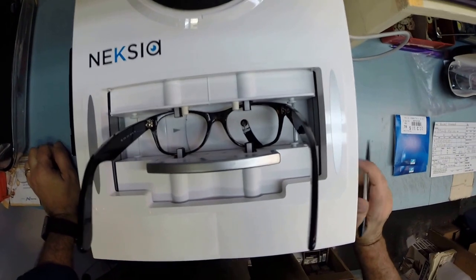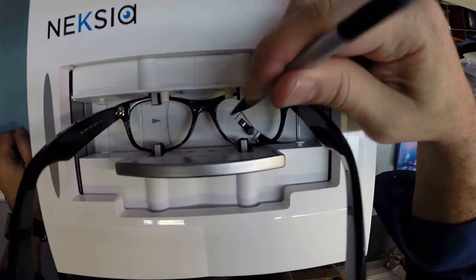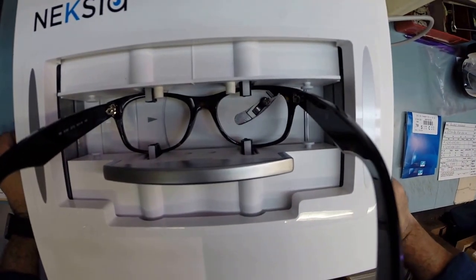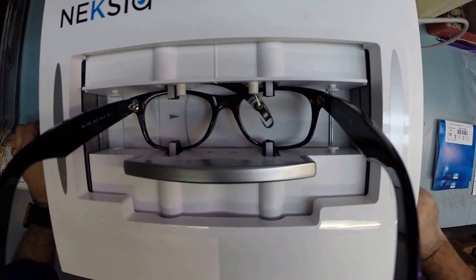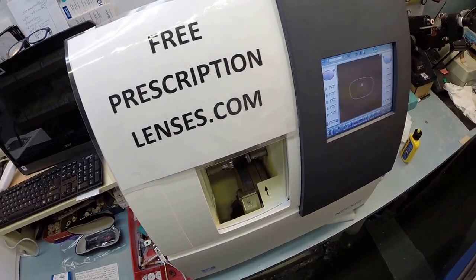I'm gonna take your frame, wake up the computer, and begin to trace the shape of your frame. A stylus is gonna pop up here and trace the shape of the right lens before moving over and tracing the left.